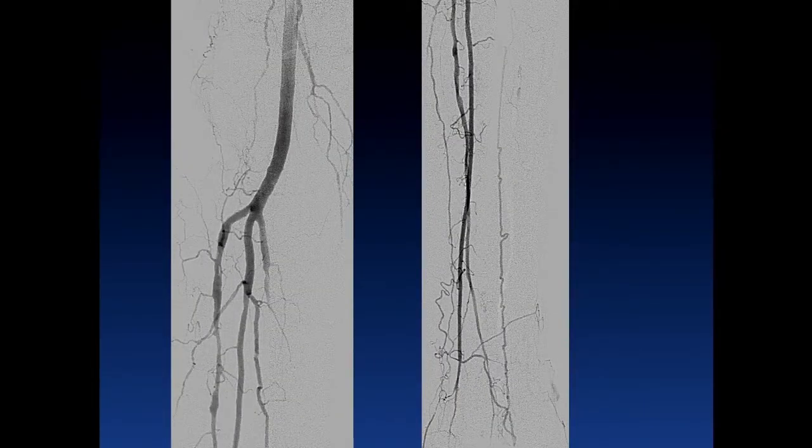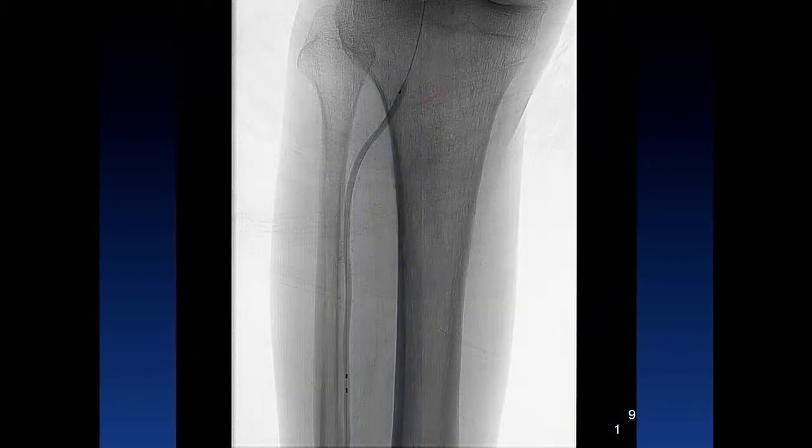You can see that after that, there was some improved flow down the anterior tibial with essentially straight line flow, but a fair amount of recoil in the proximal to mid segment. I think the initial balloon was fairly undersized. So I then went in with a subsequent balloon. This was a 3.5-3.0 by 220 balloon. So this is the 3.5 portion, this is the mid segment, and then the more proximal half of the balloon, some of which is not shown here.